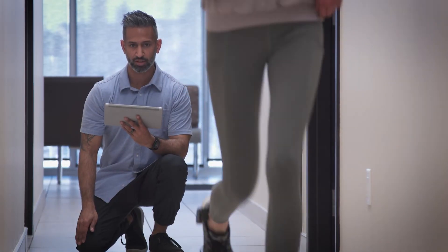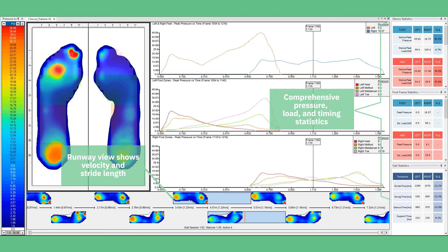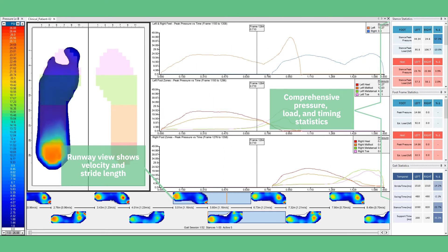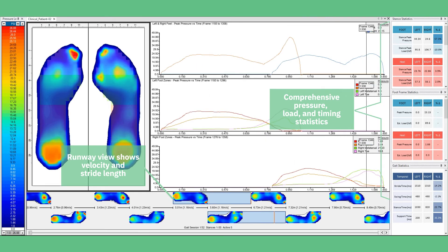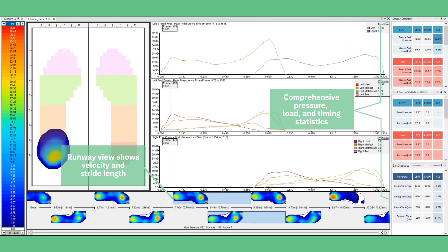With a battery that lasts over seven hours, the sensors are ready to use through the entire clinical day. An integrated inertial measurement unit provides additional context when capturing and reviewing data, and the IMU and pressure data provide accurate temporal measurements for functional gait assessments.